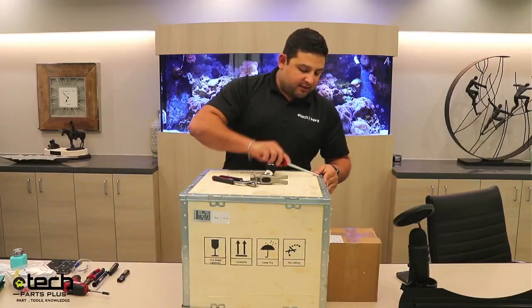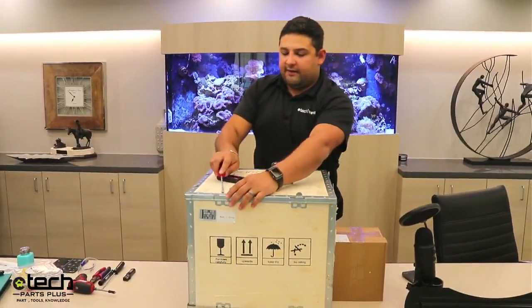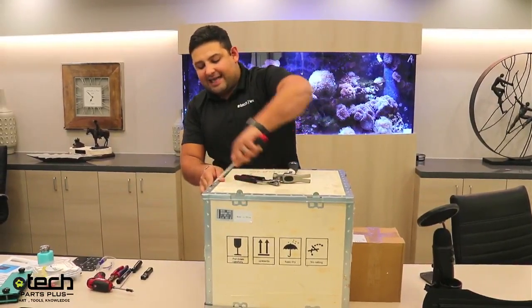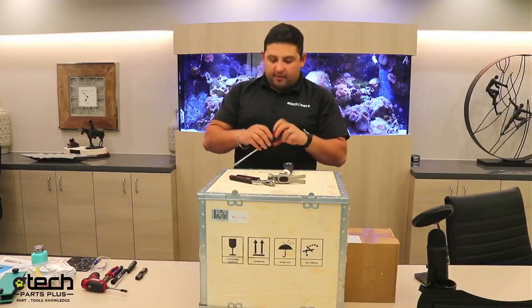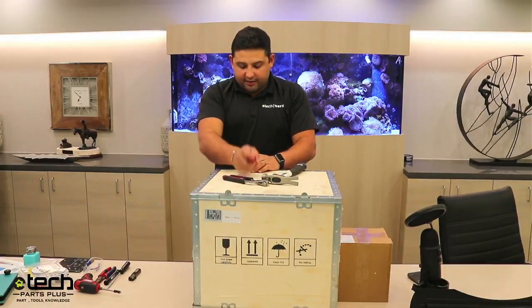First we're going to bend up all the tabs — there's a total of eight, two on each side. These vary; sometimes they are bent downwards, sometimes they're bent upwards. We try not to bend them too much so it's easy for you to open, but we also want to make sure that in transit nothing happens so the lid doesn't come off or nothing comes loose.